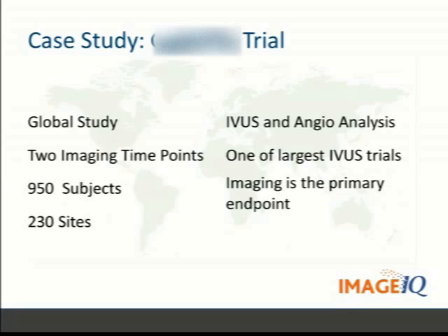So anyway, the trial itself is an imaging trial. The IVUS is the primary endpoint of this study. Which is unique, actually, isn't it, right? It is. Imaging endpoints are usually a secondary or observational or that type of thing. So it's a very exciting type of study to be a part of. So we'll be collecting the intravascular ultrasound, or IVUS, and the angiographic exams at the baseline, and then at follow-up just the IVUS.